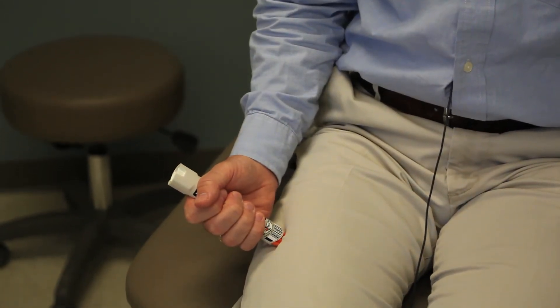Same idea — you place it on the outer thigh, press down, and count: 1, 2, 3, 4, 5, 6, 7, 8, 9, 10. Pull it out — you're done. After using either the EpiPen or the AviQ, you're going to use it and then call 911.